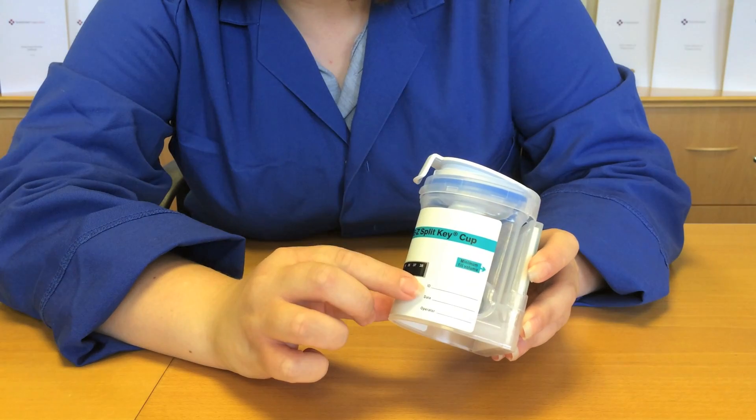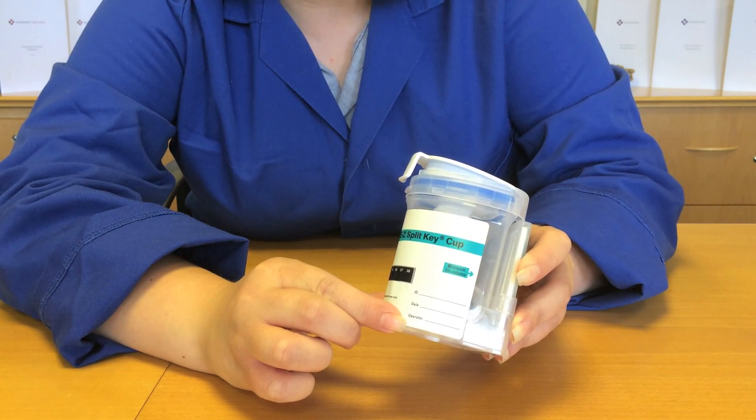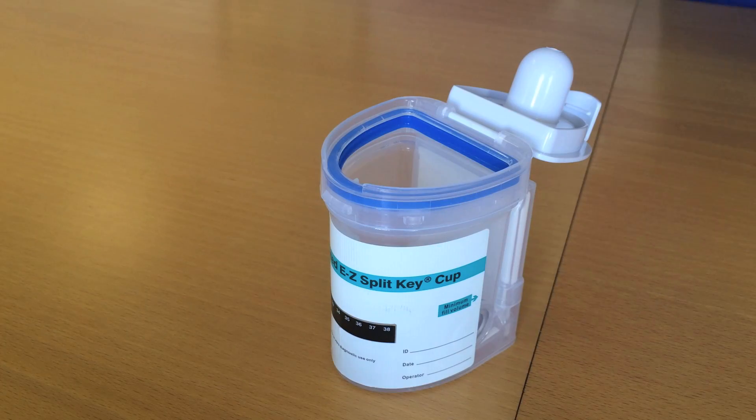You can also write the donor ID, date, and operator on the side panel of the cup if necessary. Have the donor urinate into the test cup, ensuring that the minimum fill level is met, otherwise the test may not run correctly.